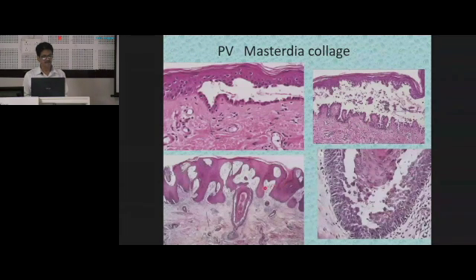Now here you can see in the third diagram that there is involvement of the suprabasal in the hair follicle also. Although there is no blister, you can see the line of suprabasal location, the split has occurred. This is the same again at higher magnification.